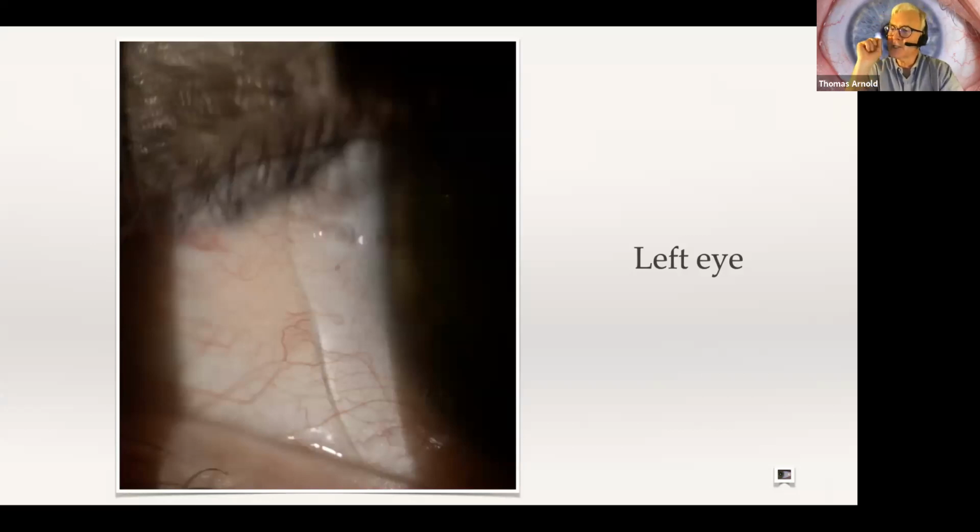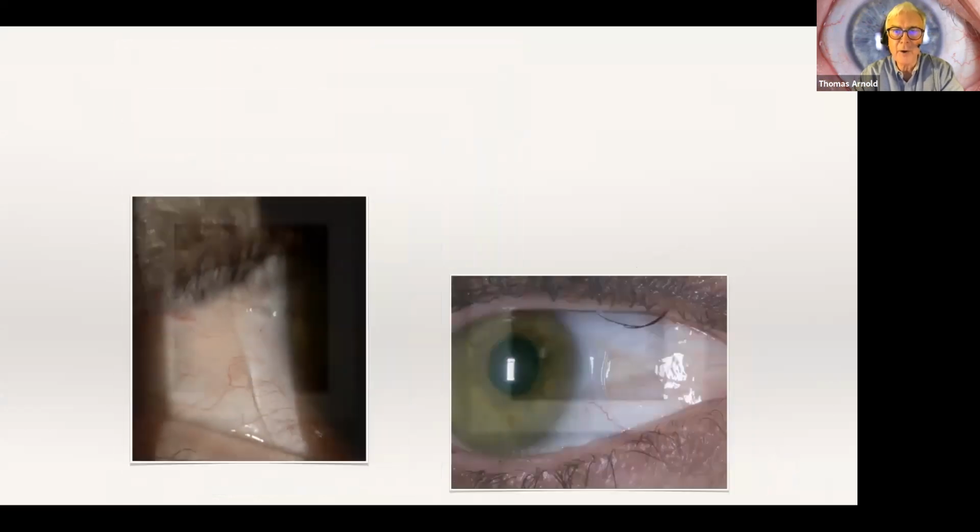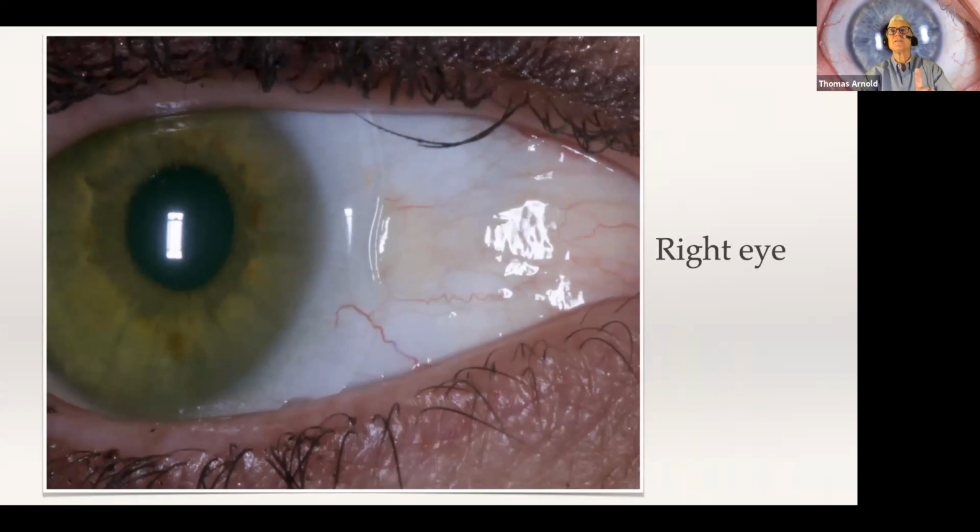And because it is in the laser program, this lens can be replicated exactly time after time in case of breakage or a spare pair or something. So we've come a long way from just taking our little Dremel tool and cutting it out. Okay, and this is not unusual. She wanted a scleral lens for the right eye. Even though the right eye was normal, you recall that this is an ectasia, the left eye. The lenses were so good, she got one in the other eye, and she probably had a bigger pinguecula here. And again, you can see how it goes nicely over it. It's not red. It's not congested. So this is really the way to go on that.